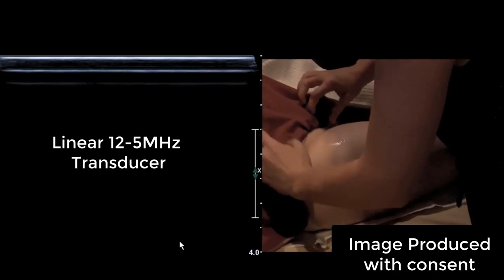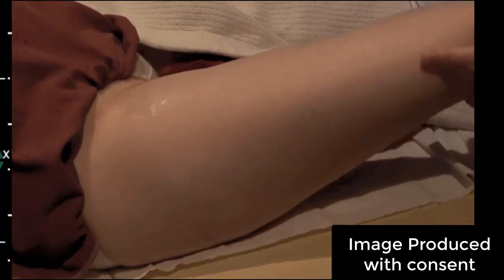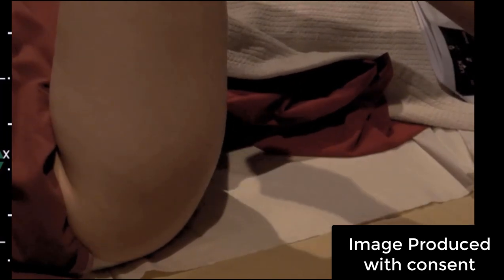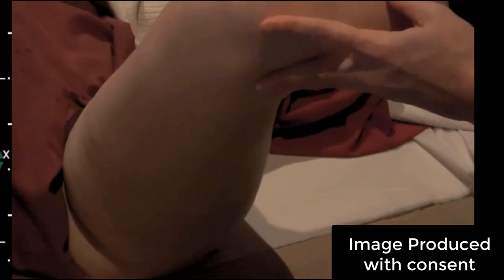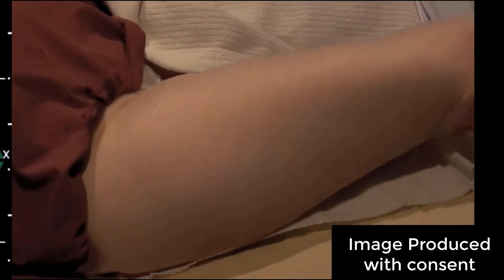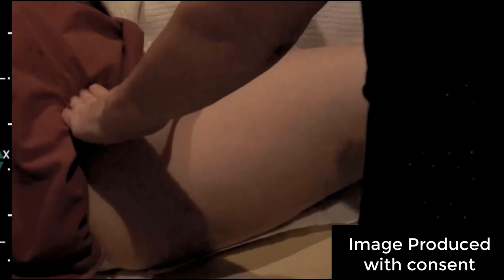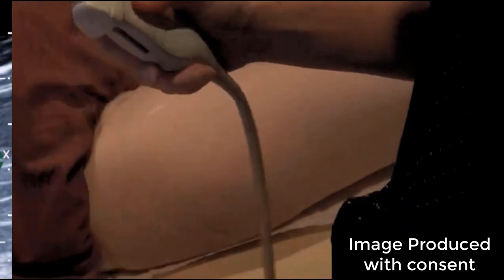So it's good if you can coach your patient how to do it first. So obviously the first position is up to flexion, so I just call this tabletop. Then you're going to have to try and find the tendon. And then we come out to the side, get them to pause, and then they do one big circle like that. And try and palpate it. So you'll feel the click under the transducer, which is helpful. So let's see if we can find it.